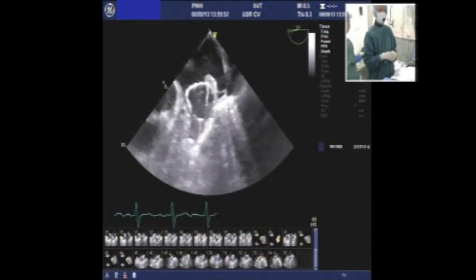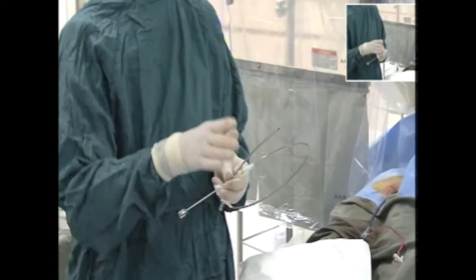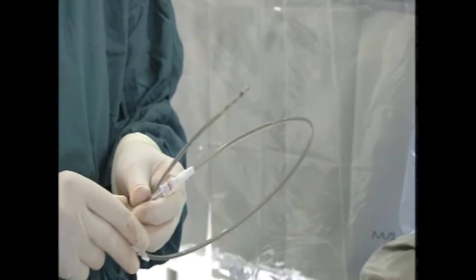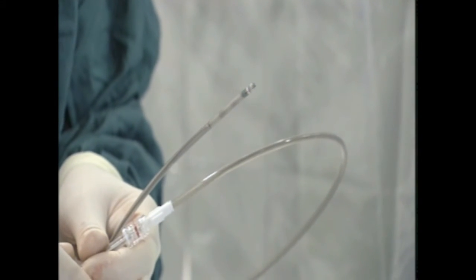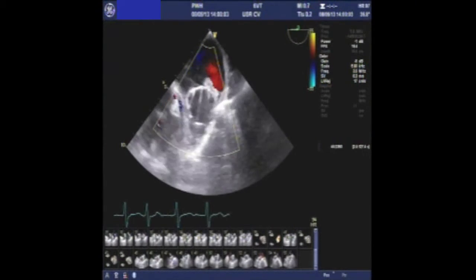Let's go through echo first. Finish the echo first, and then show the demo. Echo, let's show please, to see how you assess the leak and assess the compression. This I think is important. Echo full screen first. Okay, we have it.